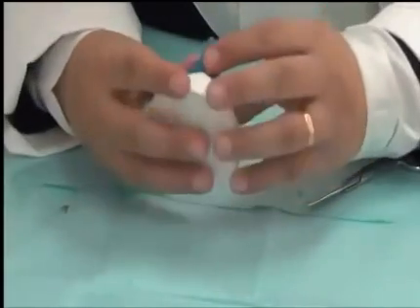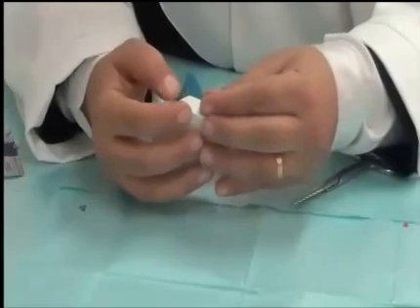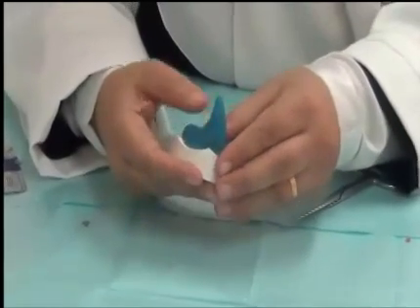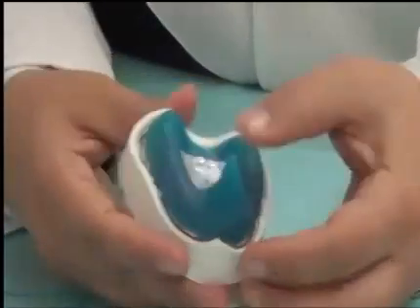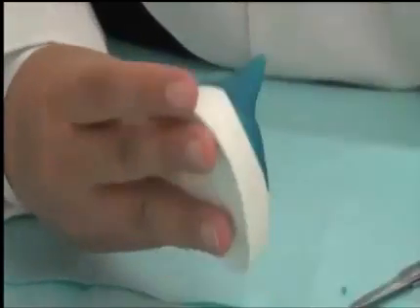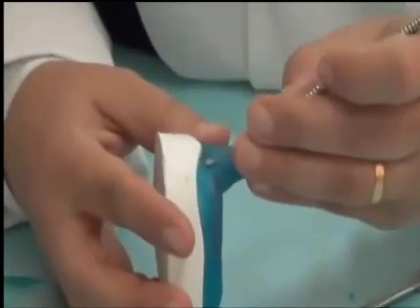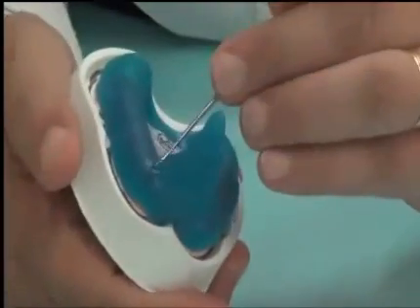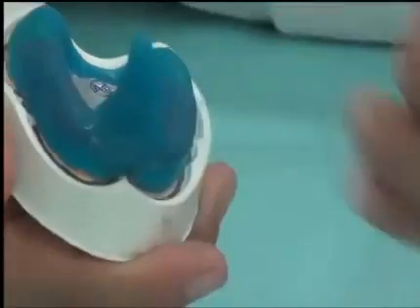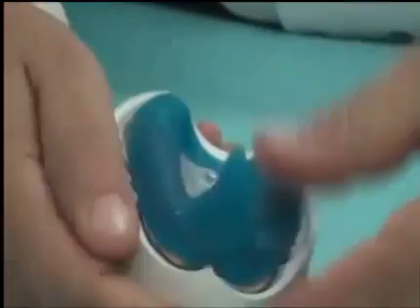Once we have adapted it like this, we keep pressing on the sides until the junction between the handle and the tray becomes smooth. You don't see any lines between the two materials. So, this is the first issue. We make sure that from all sides the parts are fused together.